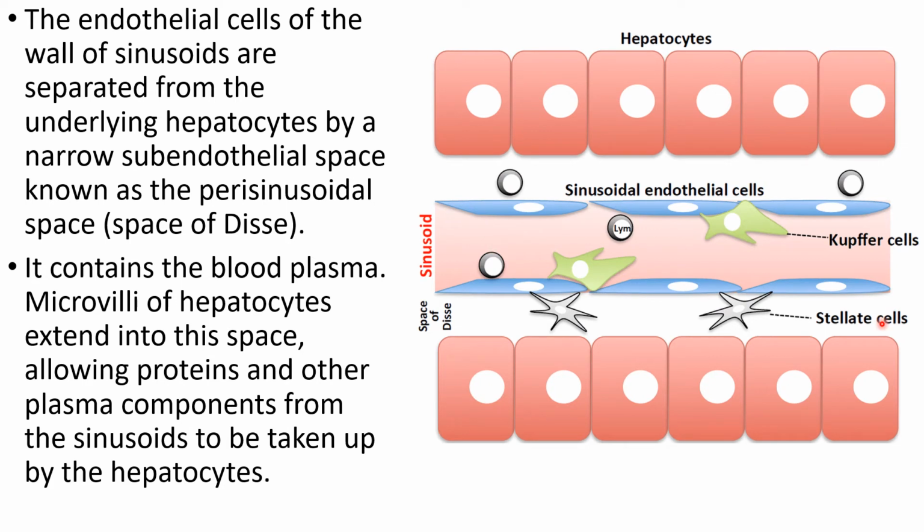Microvilli of the hepatocytes extend into this space, allowing proteins and other plasma components from the sinusoids to be taken up by the hepatocytes.